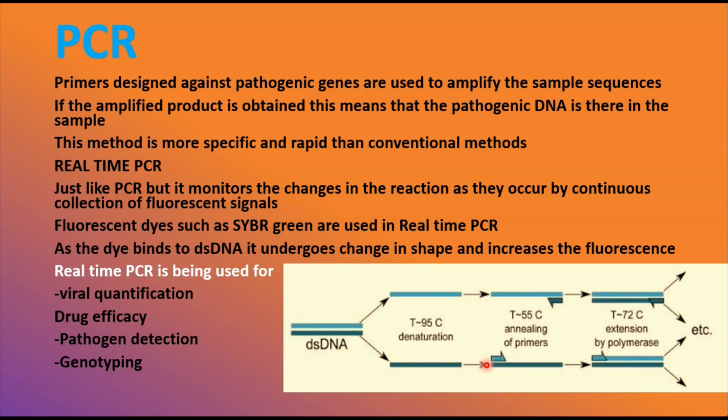The PCR method is performed in repeated cycles so that the products of one cycle serve as a DNA template for the next cycle, doubling the number of target DNA copies each cycle. So here you can see the rapid increase in the number of copies of the target sequence that can be achieved with PCR-based methods, which makes them ideal candidates for the development of faster microbiological detection systems. Many PCR techniques have been validated and commercialized, making PCR a standard tool used by food microbiology laboratories to detect pathogens in foods.